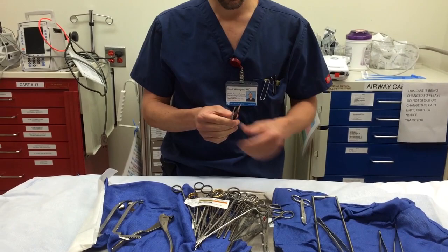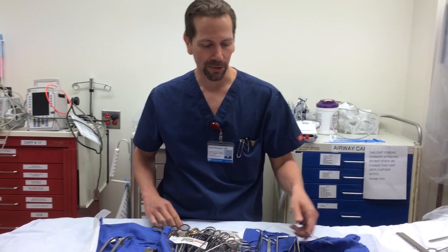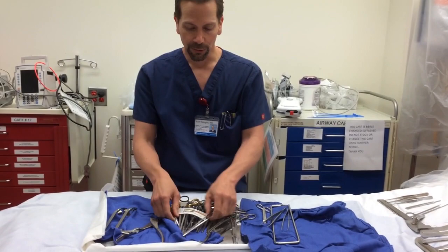Now you're through the sternum, you have a clamshell, you put your Finochietto in, and you're ready to do something. The first thing is to relieve any possible pericardial tamponade, or check if it's there. For that, you definitely want at least one pickup with teeth — teeth are important because when the pericardium gets tense, non-toothed pickups can't grab it. Because they inevitably fall on the floor, it's not a bad idea to have two pickups with teeth.